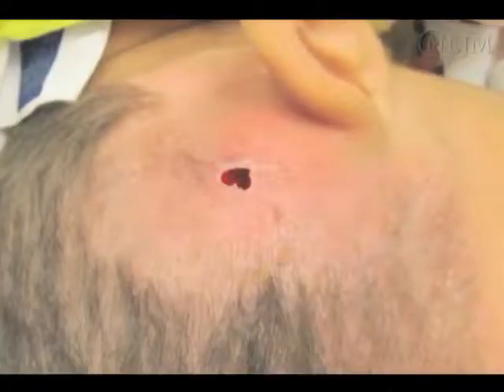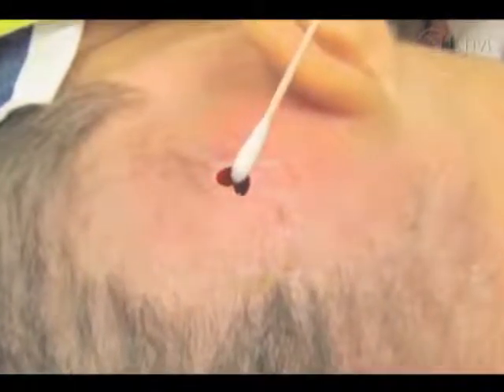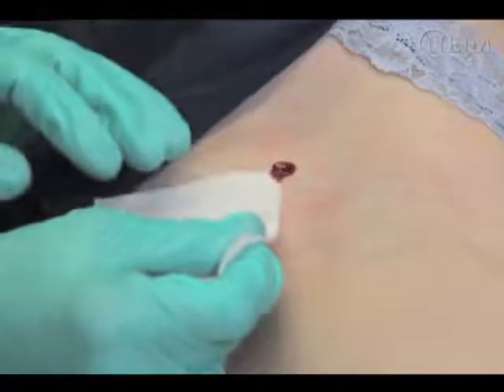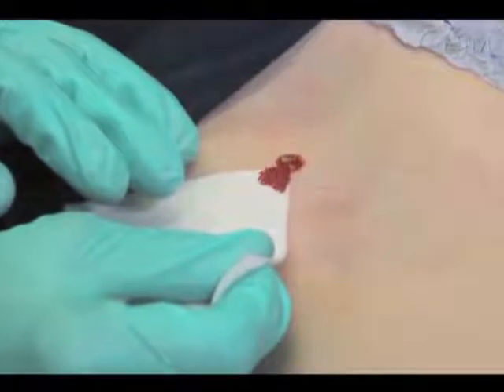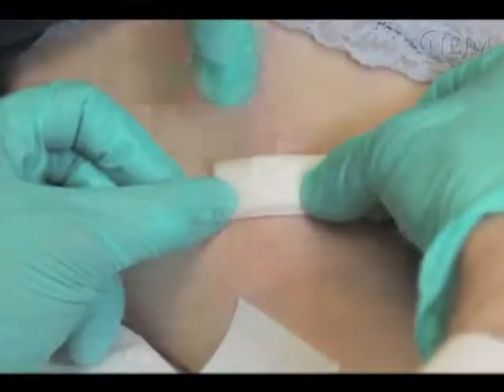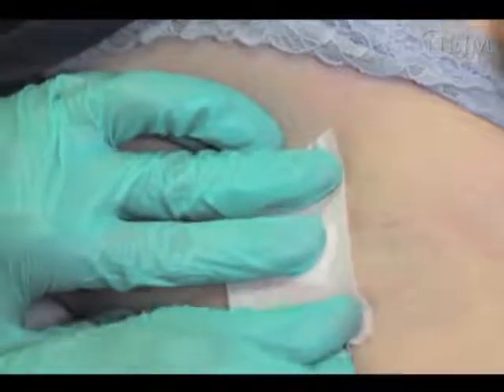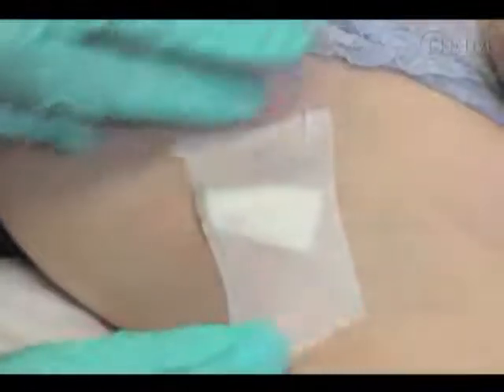On the scalp, bleeding may be brisk. The assistant can occlude the punch defect with a cotton-tip applicator so the surgeon can visualize suture placement. Alternatively, place the corner of a gauze at the punch defect — the gauze will absorb the blood flow by capillary action, allowing visualization for suture placement. In patients with thrombocytopenia or those taking an anticoagulant, it is typical to place a pressure dressing over the sutured site to prevent late-onset bleeding, and it can be left on for 24 hours.